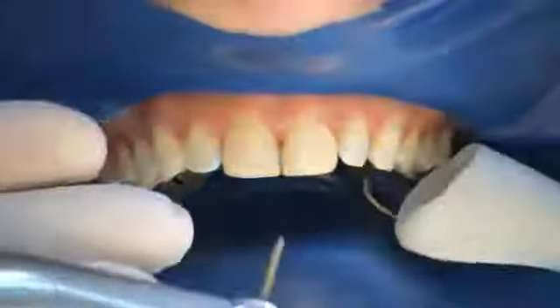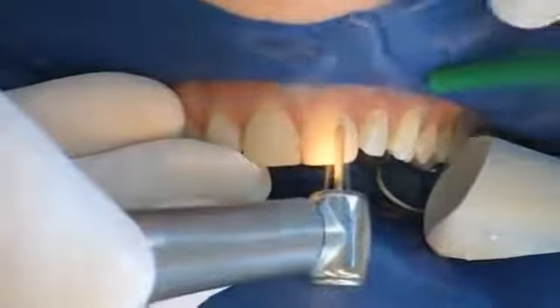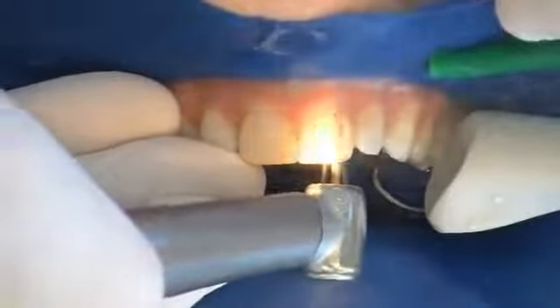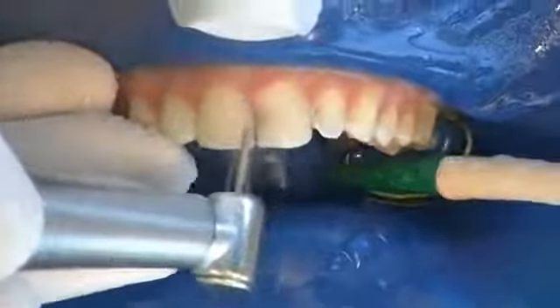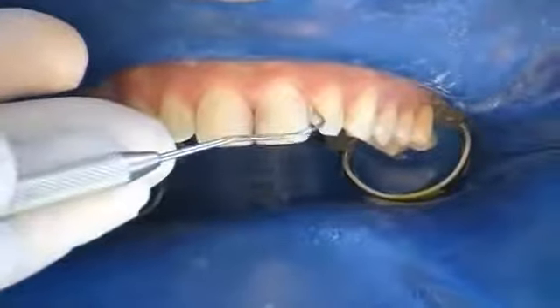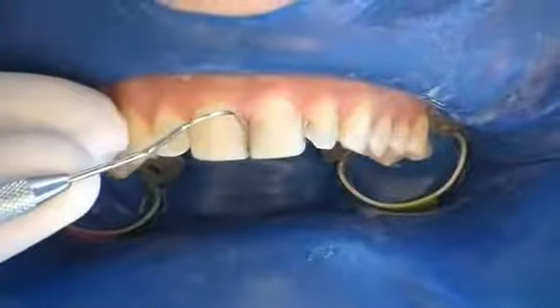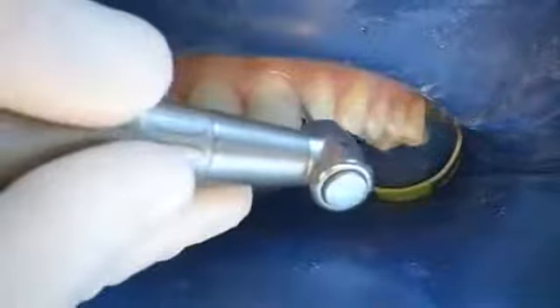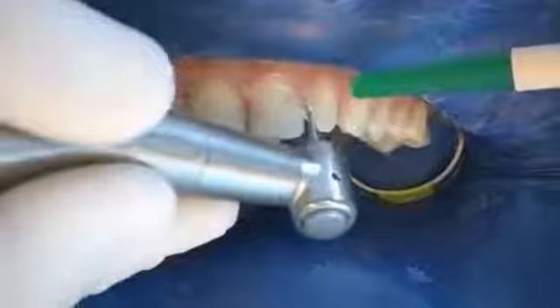If necessary, a reduction of the tooth surface is carried out, removing as little dental hard tissue as possible. A defined preparation margin as well as shortening of the incisal edges is not necessary. The teeth are checked for caries and old fillings. Caries in the dentine is removed in the conventional way, as are demineralized and discolored parts of the enamel.